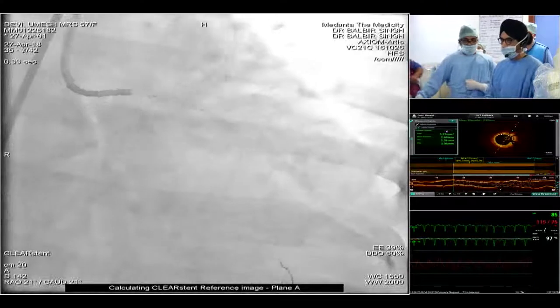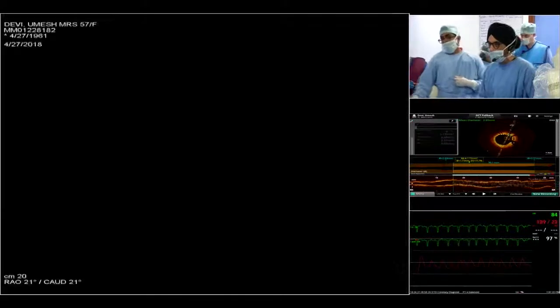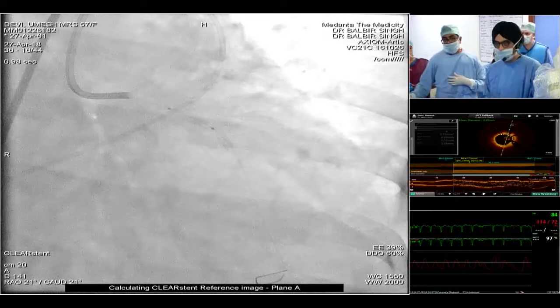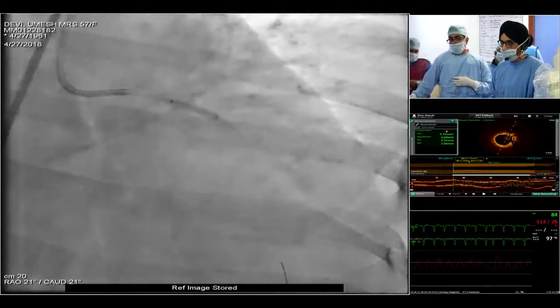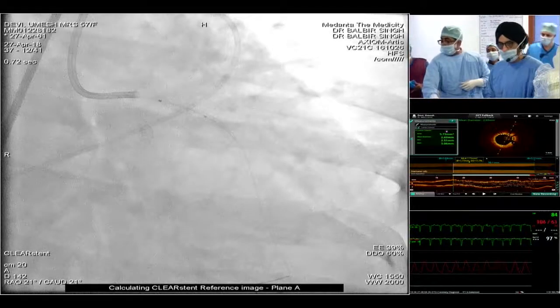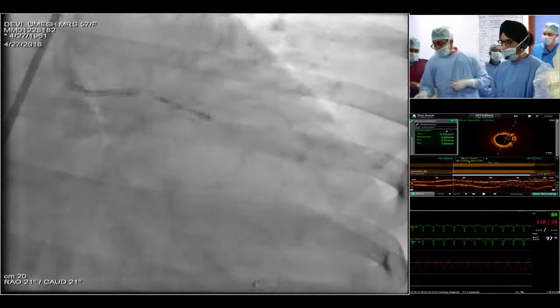Show. And I would definitely like to do an OCT at this ostium. Look at the ostium, the stent has not even flared up at all. 20. Yeah, it seems that the position of the stent 22 is very good. It covers the ostium but doesn't protrude to the circ. Down. Show. Okay, 12, 14, 16, 18, 20, 22, 24. Down.